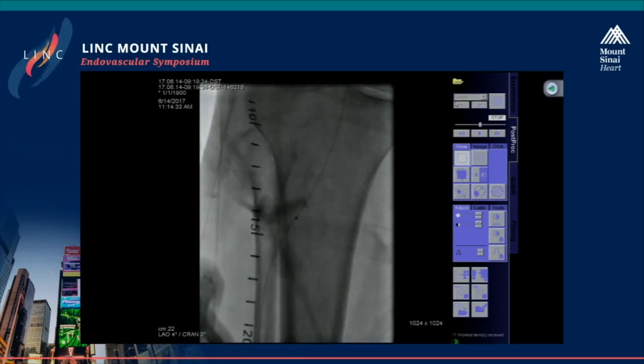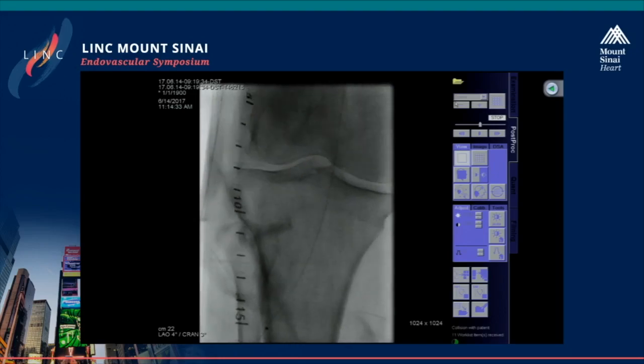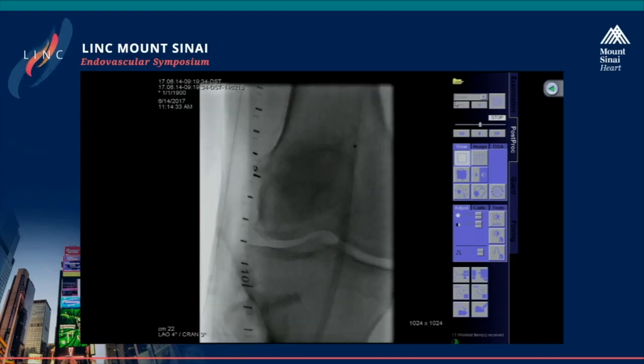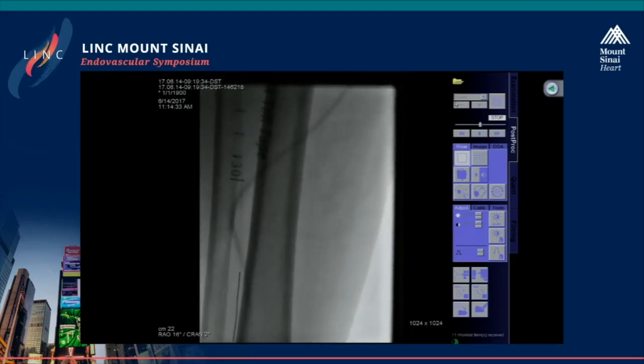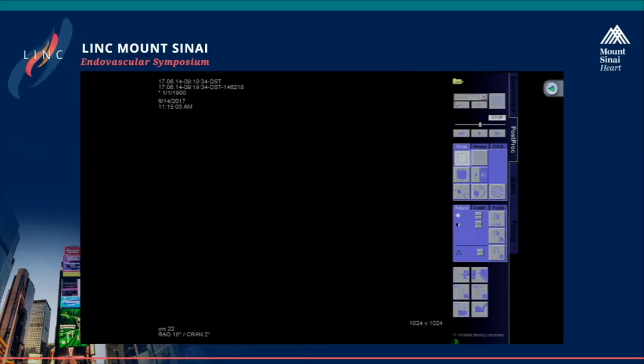Yep. I would like to ask Dr. De Robertis, have you seen any aneurysmatic degenerations after paclitaxel delivery post-atherectomy? So I've not experienced any aneurysm formation after the combination therapy of DCB and atherectomy. I have, I believe it's 3 patients with ectasia of the vessel or aneurysm, early aneurysm formation.